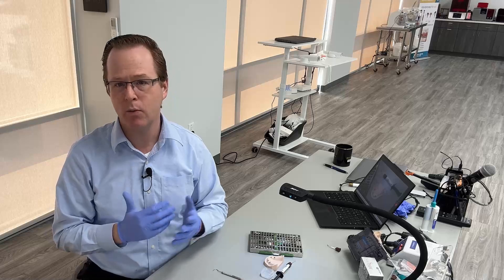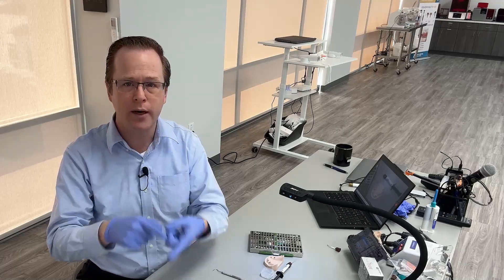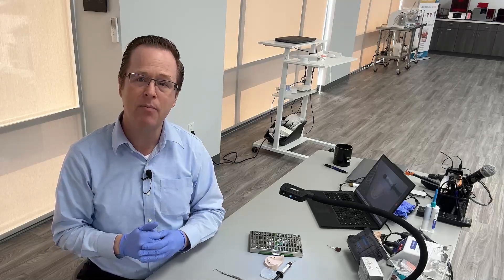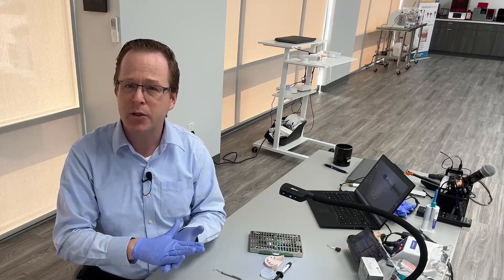I've got my setup right in front of me here. I have my educational model with my implant that has the 15-degree angles in the posterior. We've just recently placed our two traditional locators in the front and our two angled locators in the posterior. Additionally, I have my crown delivery kit for my clinical practice, which also includes a pair of iris scissors, a small condenser or plugger, some composite material, and a curing light.